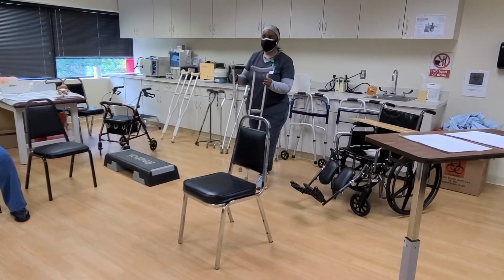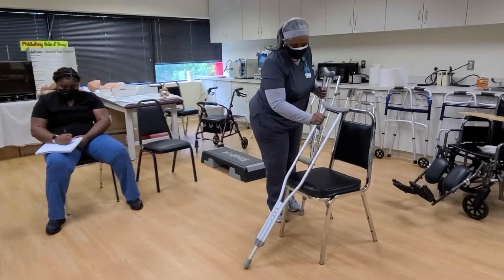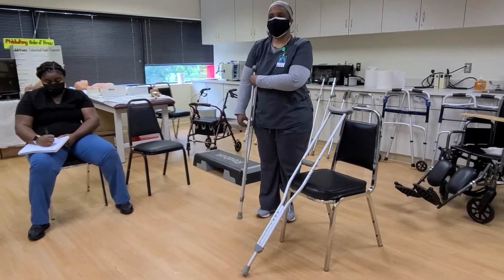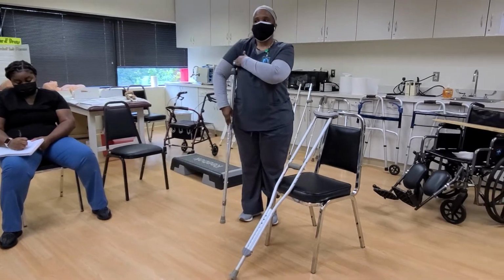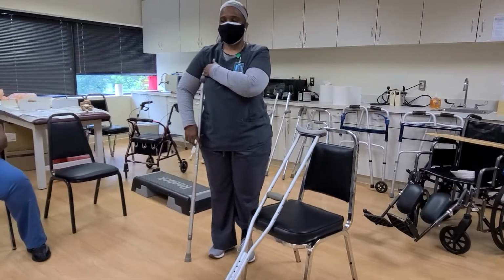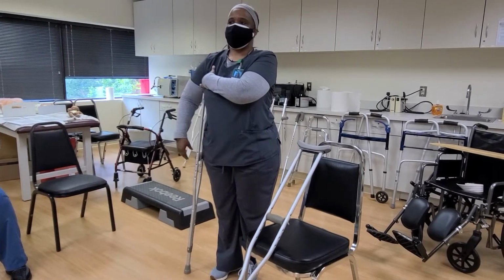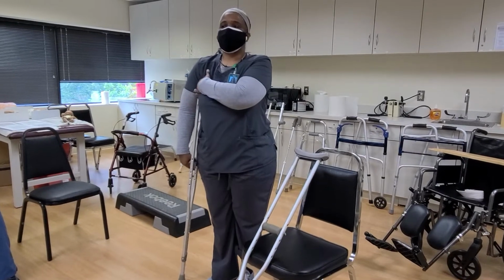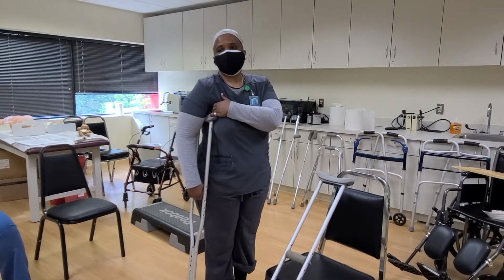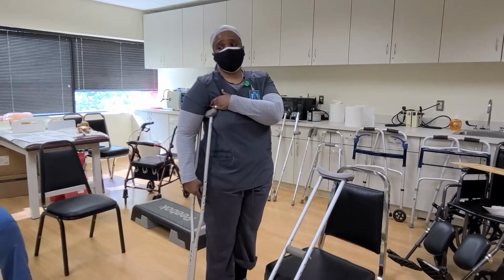Now, with crutches, again, it usually should be for people who are younger and who have good balance. The first thing I want to do, just like I did before, is measure, but instead of the wrist, this time we measure to the armpit first. The wrist is going to come afterwards, but the armpit is first. As you can see here, it's not too bad. I have 3 fingers. You should have at least 2 to 3 fingers that you can put under the patient's arm, okay? That means I have enough room that when I'm leaning, hopefully I won't cause too much irritation or compression of the nerve, okay?